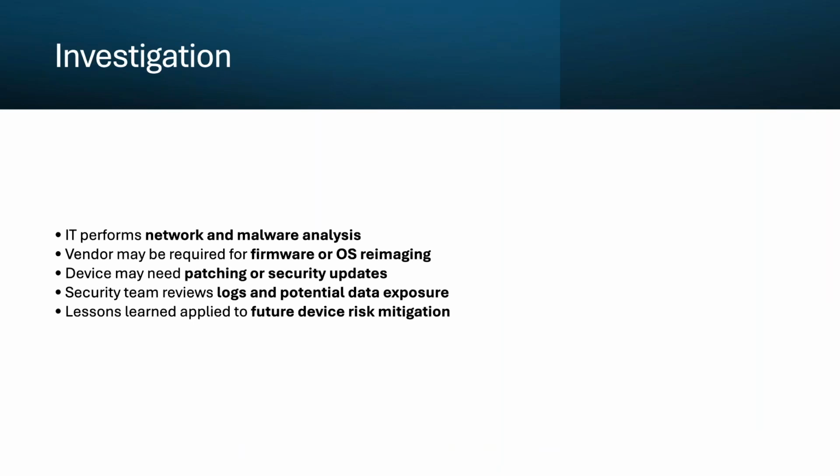In many cases, we'll need to involve the device vendor. Here's an important point to understand. Medical devices aren't like laptops that we can simply wipe and re-image ourselves. These devices often have specialized firmware and operating systems that require vendors' expertise and authorization to modify. The vendor may need to perform firmware or operating system re-imaging to ensure the device is clean and functioning properly.